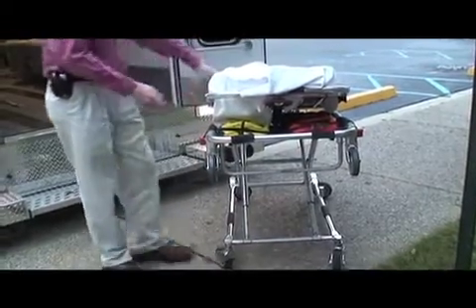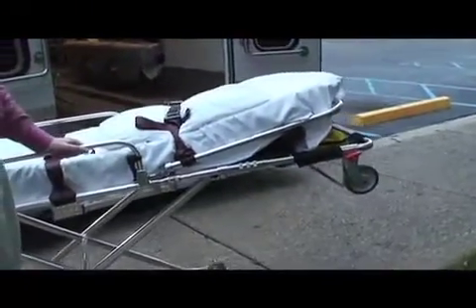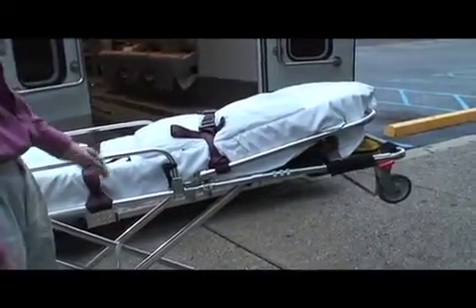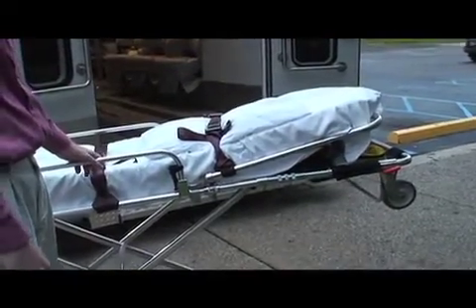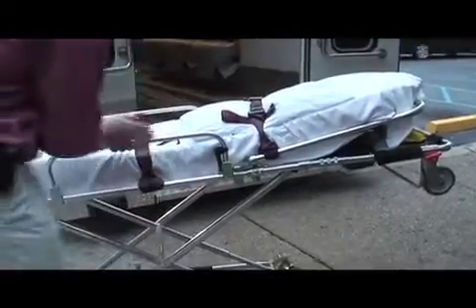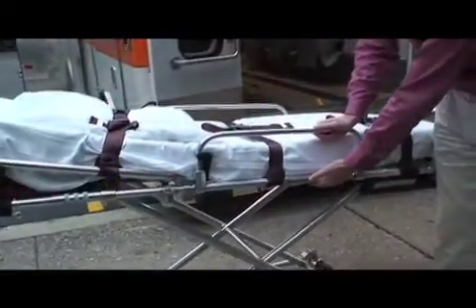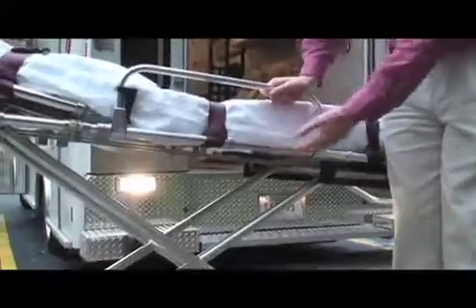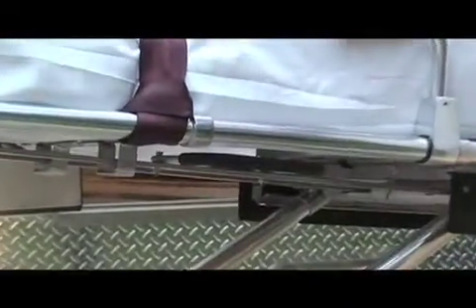Okay? Raising and lowering the stretcher: these Bonheurs are two-man stretchers. You can't really operate them with one person with a patient on it. There are a few things that you can do with one person when there's not a patient on it. One of those, on this side, is a handle located right here next to this handrail that you can use without a patient on there to raise and lower the stretcher by yourself to an appropriate height.